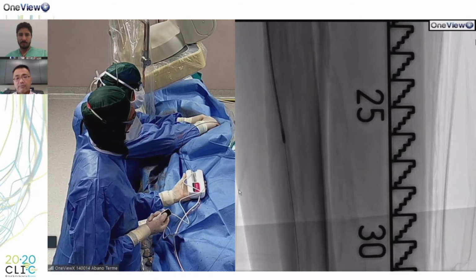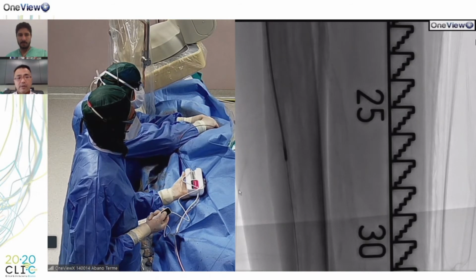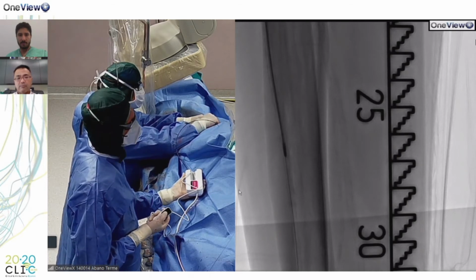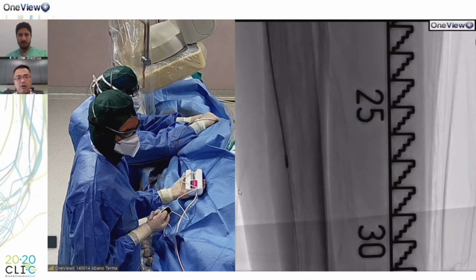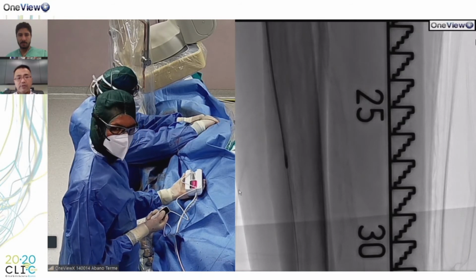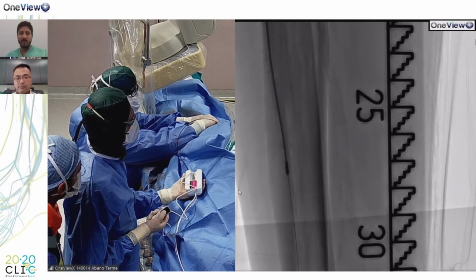Sometimes it's actually pretty unpredictable. So in a patient with a desert foot, for example, I certainly would be very cautious about atherectomy. But in this case, I think it's a reasonable option to try and change the plaque morphology and maybe improve balloon angioplasty and allow better drug absorption. But again, for below the knee orbital or rotational atherectomy in combination with drug-coated balloon, there is actually no very strong evidence to suggest that. Okay, thank you, Steven.